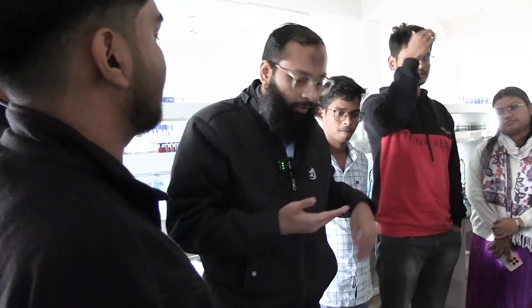যখন একটা ব্যান্ড ফর্ম মানে নিউট্রোফিল আসে কোথায় থেকে? ব্লাস্ট থেকে আসে, জানো তো এটা? ব্লাস্ট থেকে আসে, সেটা কোথায় থাকে? বোন ম্যারোতে থাকে, ঠিক আছে? তো এই যে ম্যাচুরেশন হয়, সেটাতে একটা স্টেজে আসে যেটা ব্লাস্ট হয়ে যায় প্রোমাইলোসাইট, তারপর ওটা ম্যাচিওর হয় মাইলোসাইট হয়ে যায়, তারপরে স্টেজটা হচ্ছে মেটামাইলোসাইট, তারপরে হচ্ছে ব্যান্ড ফর্ম, তারপরে ওটা হয়ে যাবে নিউট্রোফিল, ঠিক আছে?